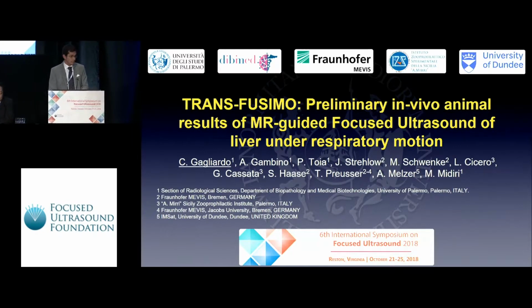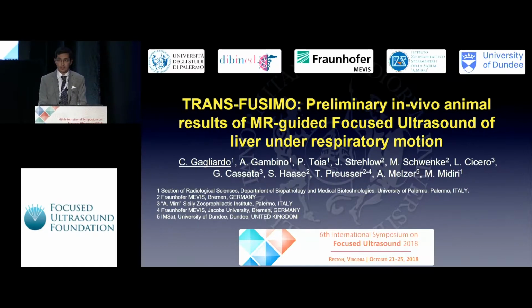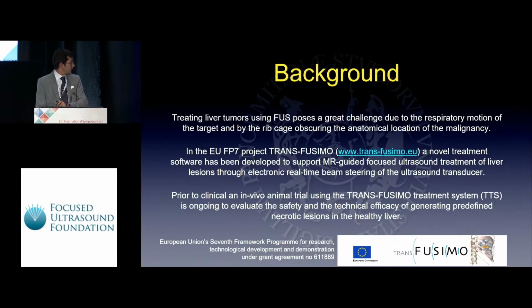Good afternoon, dear colleagues. We know also from the previous session that treating a liver lesion could be definitely a challenging task. Because, of course, our target is moving, and the rib cage is, of course, closing the open window that we can use to reach our target.